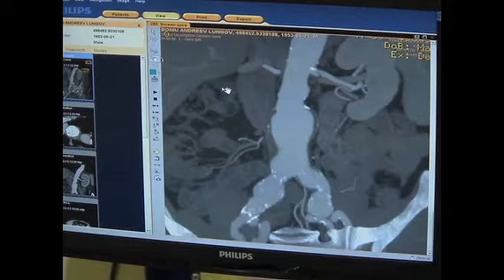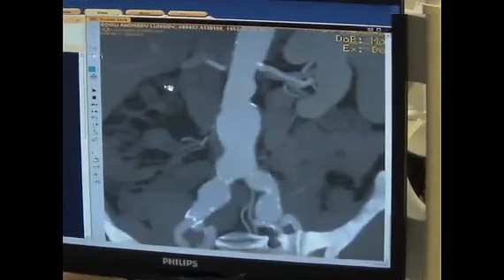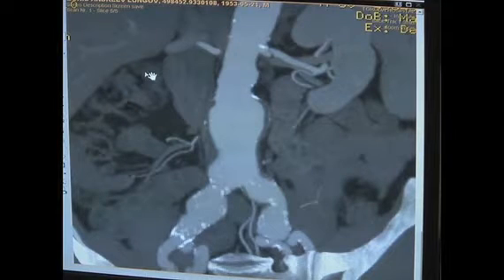So it's fitting very well to the widest diameter of the left iliac aneurysm. So, Ivo, you plan to seal at the middle part of the common iliac artery, right? Absolutely right. We are planning to open the distal left iliac leg just before the ostium of the hypogastric. Okay, Ivo, I think if you can go ahead and proceed because we don't want to lose all of our satellite time.